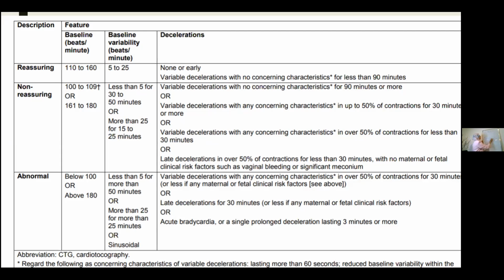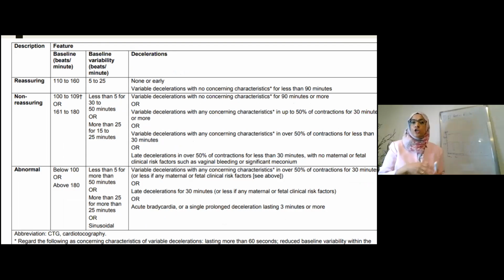This baseline that you identified to be 160 is now actually 170. That's a bit high heart rate for a baby, but it is still less than 180. But that doesn't mean that you will now be happy. You're in the amber area. So you are going to think about what is upsetting this baby that is making its heart rate go higher?